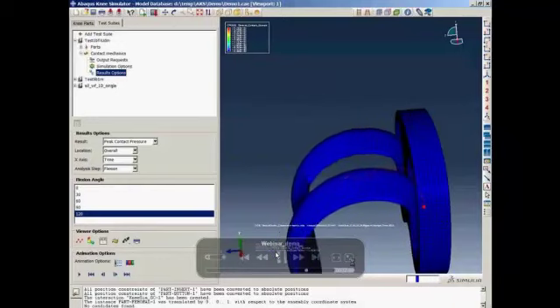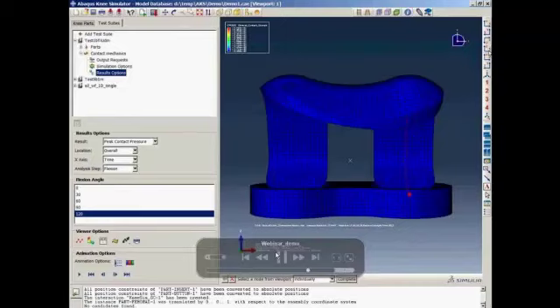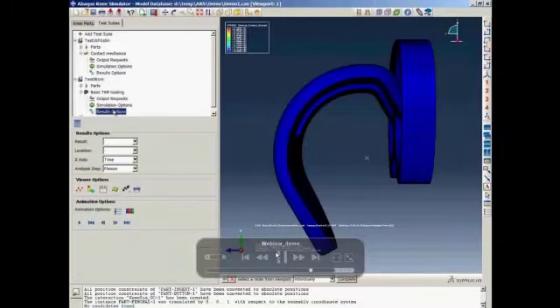And this trajectory plot can be used to study and quantify how the components have been moving at a specific point where the point has been. And they can look at different views of the trajectory. And they can also delete this trajectory from visualization.